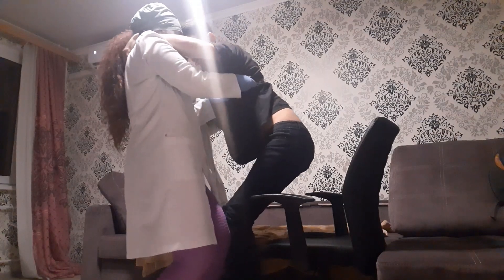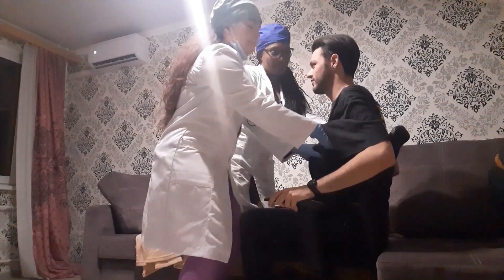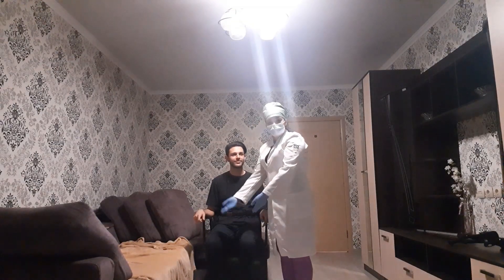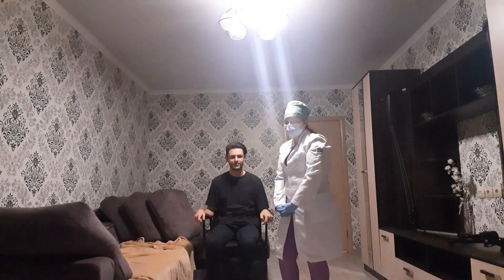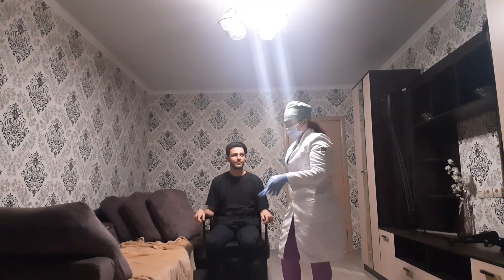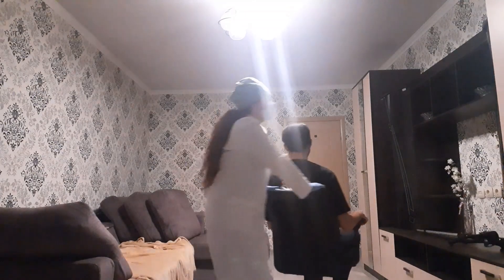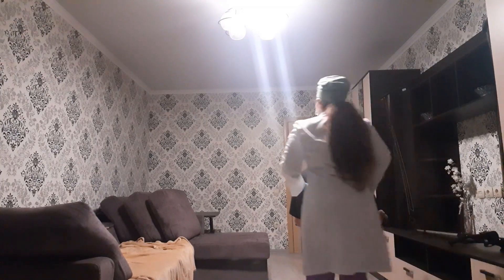And then you turn him with your arms, lean forward, and sit him down. The patient is now seated, very well seated. Again, I need to put shoes on his feet. In this case, we don't have shoes or a proper wheelchair, but we should dress him with his shoes and put his feet in the footrest support. After that, you can move him. Everything is good — let's go to the examination room.